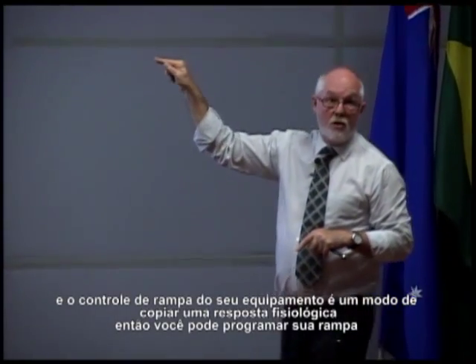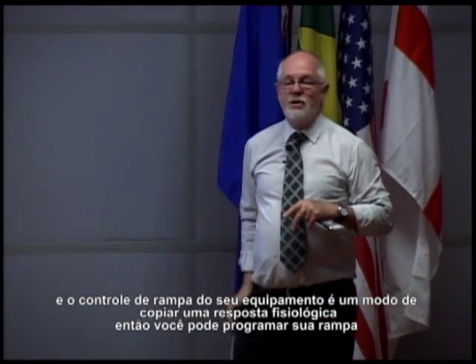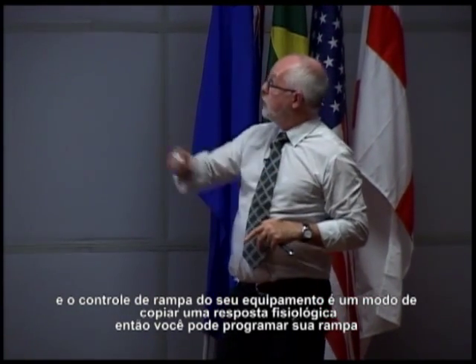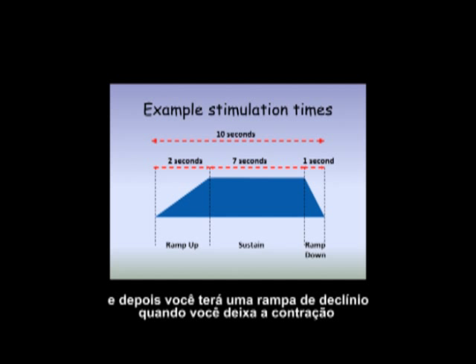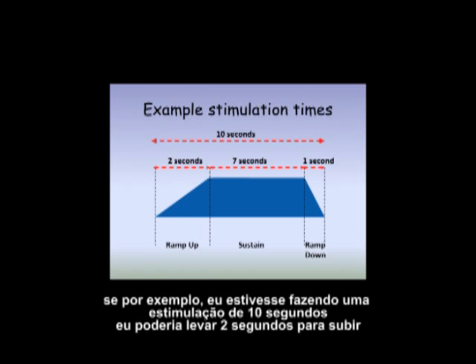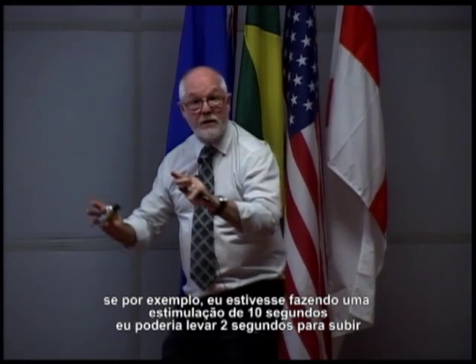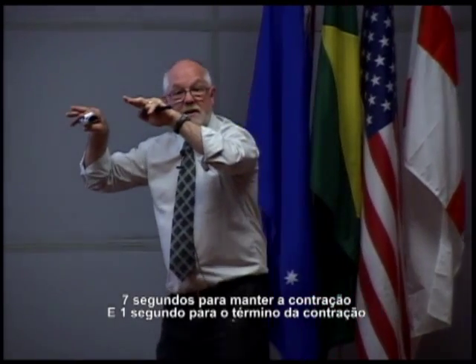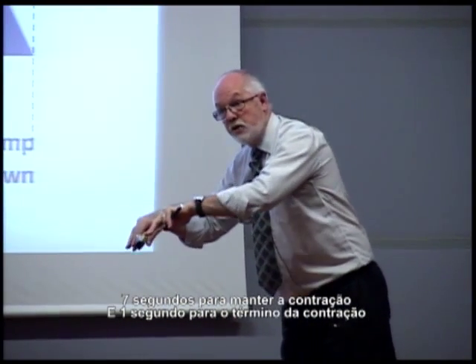And the ramp control on your machine is a way of copying the physiological response. So you can set your ramp up, the build up of the contraction. You then have a sustained period where the contraction is on, and then you have a ramp down where you let the contraction go. For example, if I was doing a 10-second stimulation, I might do 2 seconds to build up, 7 seconds to hold the contraction, and 1 second to let the contraction go.